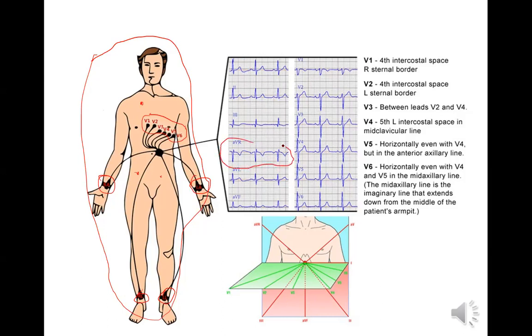Wait, for those 6 leads, those are modified too or not? No, nothing's modified on him. I know, but for like the V1 through V6, would you modify it? No, I'm sorry. It's just for limb leads. Okay. Kevin, yeah, good question. Yeah, there's never a modification.